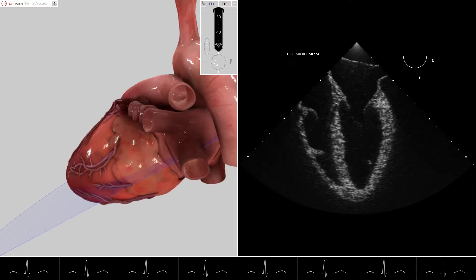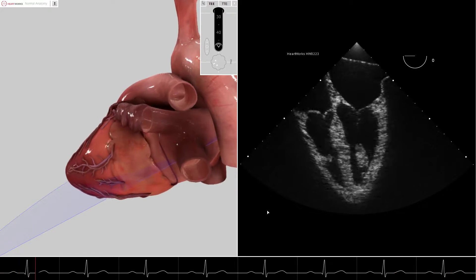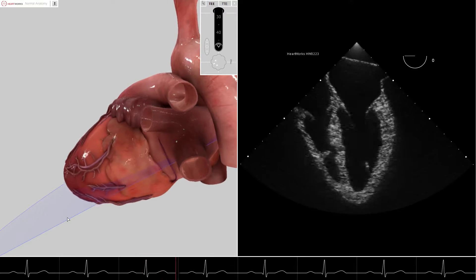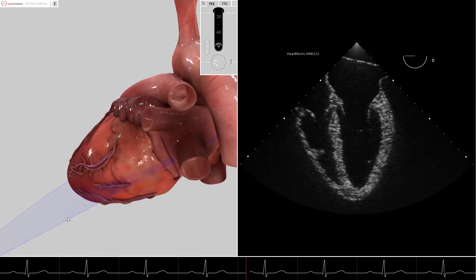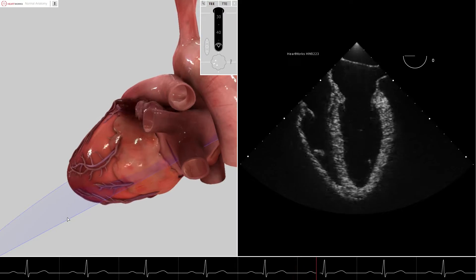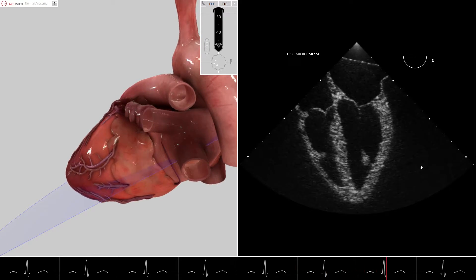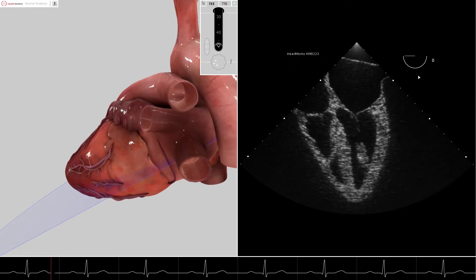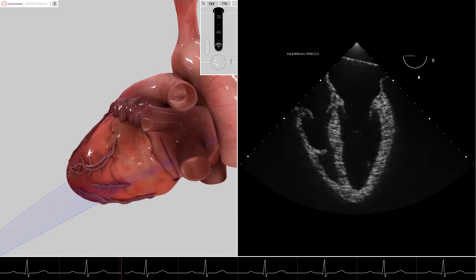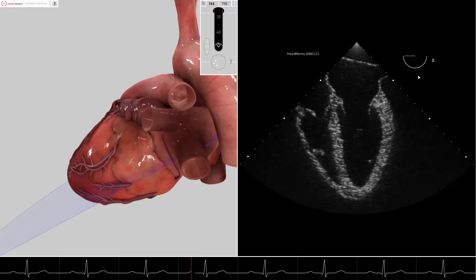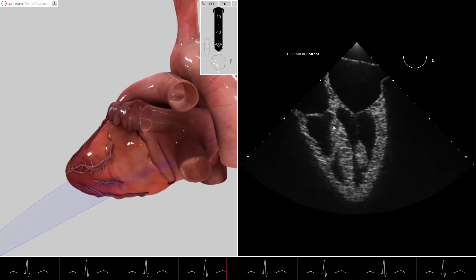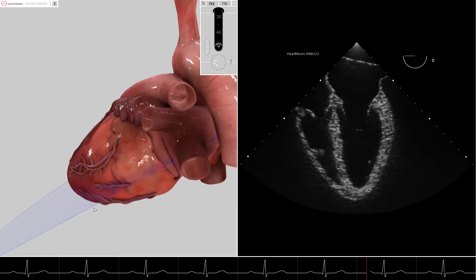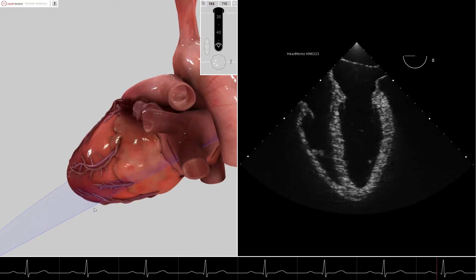For clarification, we will always refer to this left side of the purple cut plane as the marker side of the cut plane. This will always correspond to the marker side of the true ultrasound image, regardless of the omniplane position. It should be noted that in this image, the left side or marker side of the cut plane cuts through the anterior lateral wall of the left ventricle.